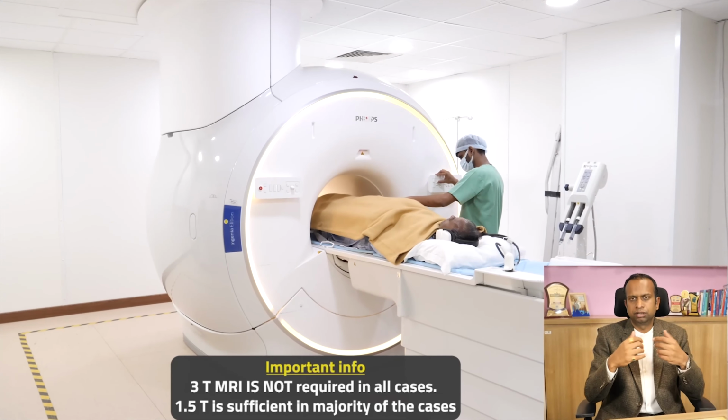Now, the next important thing is there are several machines. The commonest thing I can tell you is there are two: one is called 1.5 Tesla, the other one is a 3 Tesla. The 3 Tesla is of a better resolution, and these days these are the norm, but it is not available in all the hospitals. We have it in Aster Hospital.